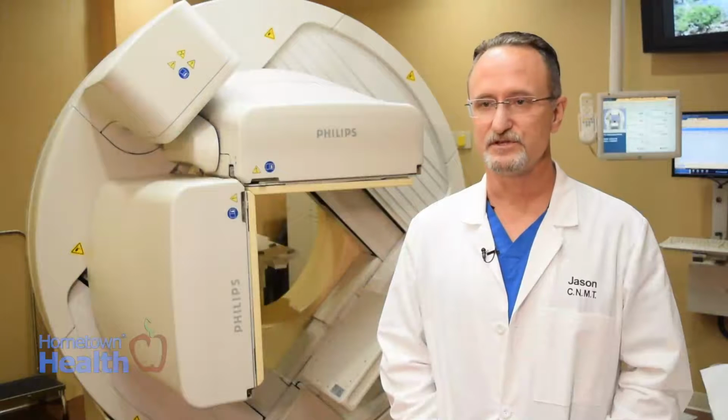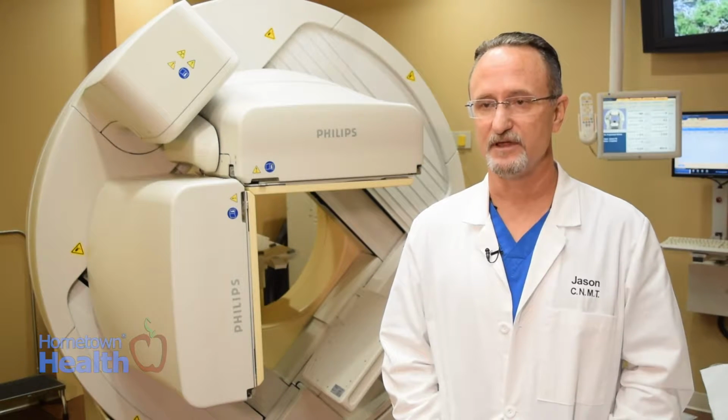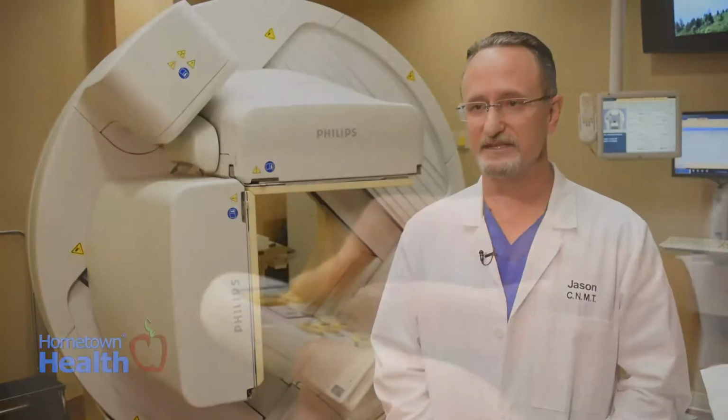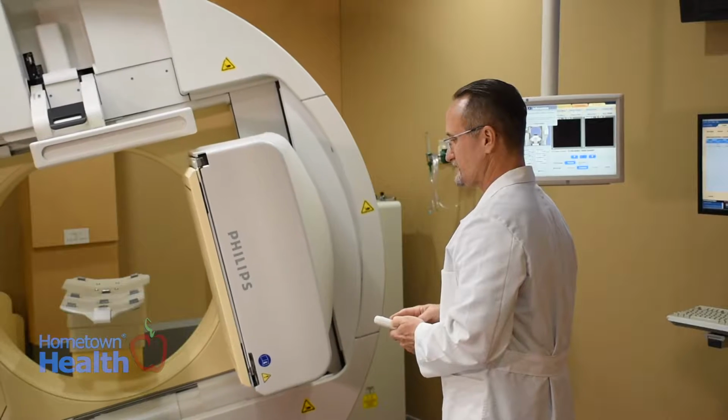At 6 hours, we also do an uptake, which gives us a percentage of the capsule that got taken up by the thyroid gland. And we also do an uptake at 24 hours as well to see if they're considered normal. The technology of the equipment that we have in ultrasound and in nuclear medicine is state-of-the-art equipment, so we're going to get the best possible images that we can get. If we do find out that it's a cancerous lesion or something we need to be worried about, we have a cancer center right here with all the experts that they need to take care of them.